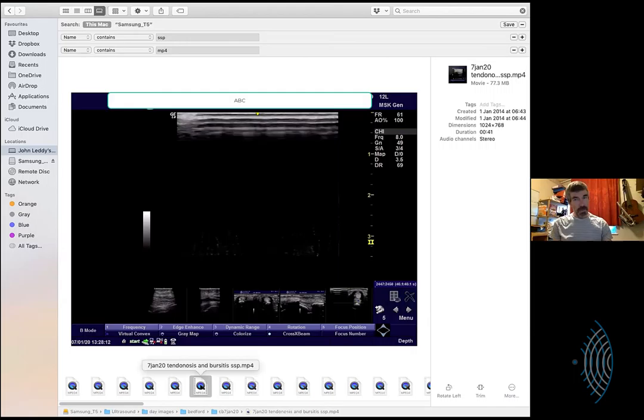There's multiple layers of fascia that can reflect incidentally. If it's bright, it's got an awful lot of boundaries. The liver can be quite bright if it's got lots of fat in it. That's not fibrous in the sense that you think about it, but it's just a lot of marbles lying together, and they're all reflecting sound back. So that's what you get.